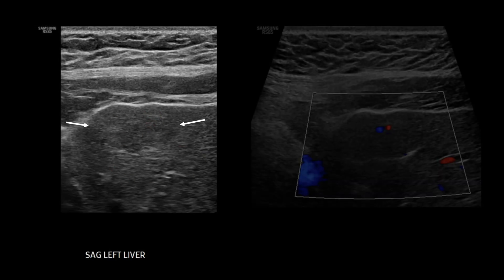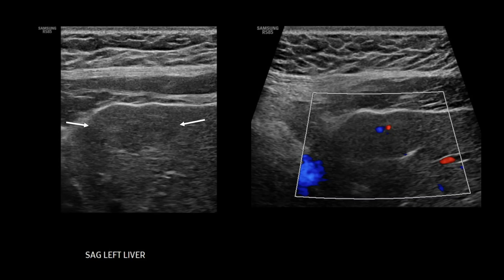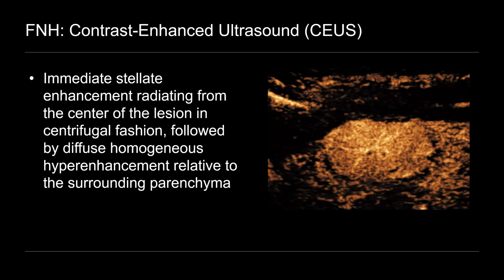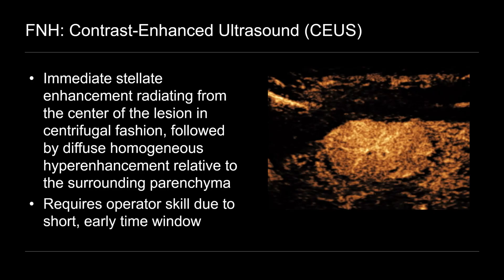So let's now take a look at how contrast ultrasound can help us make the diagnosis of FNH. This was a different patient, a female in her 30s, that presented with an incidental subcapsular left hepatic mass identified on ultrasound. It's rather subtle, slightly hypoechoic relative to the surrounding hepatic parenchyma. On color Doppler imaging, there is some mild internal vascular flow within the central aspect of the lesion. So what we're looking for on contrast-enhanced ultrasound in order to make the diagnosis of FNH is a pattern of immediate stellate enhancement radiating from the center of the lesion outward in centrifugal fashion, followed by diffuse homogeneous hyper-enhancement relative to the surrounding liver parenchyma. And to identify this stellate or spokewheel enhancement, it does require some operator skill due to the short, relatively early time window, as you'll see.